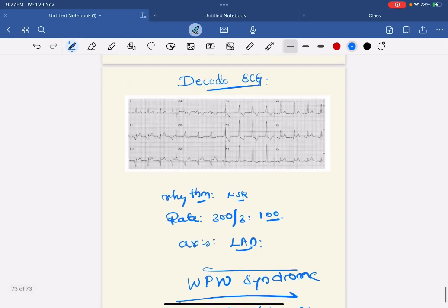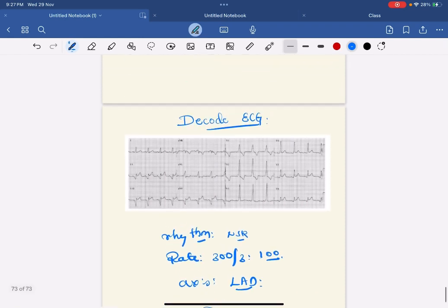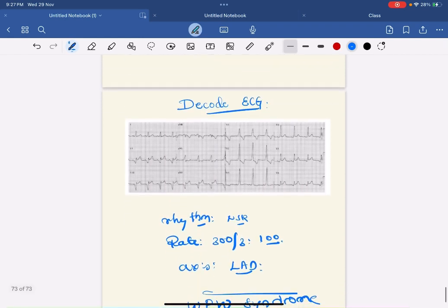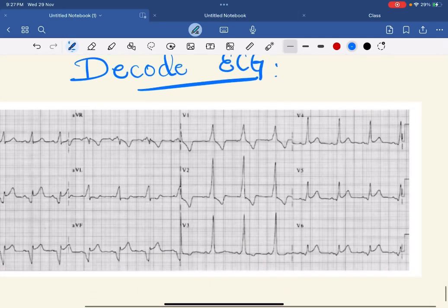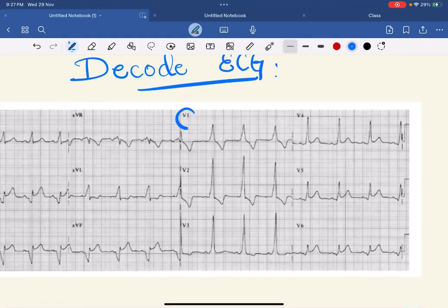Once you diagnose it as WPW syndrome, you have to localize the bypass tract - where it is, whether it is on the right side or left side, whether it is in the free wall or septal, posterior and anterior. For that you have to look at the V1 lead. V1 will tell whether it is on the right side or not.